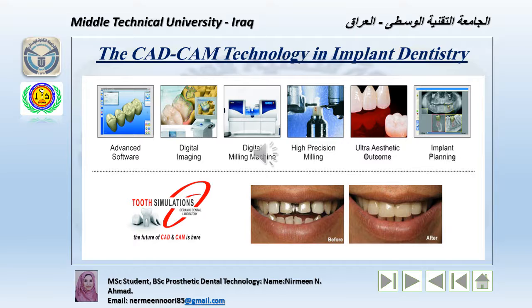Implant position within the virtual model of the patient's mouth considers the available bone density, the distance from the adjacent teeth and other implants, the fixture's proximity to the sensory nerve, and the relationship with the prosthetic end result. The designed implant placements are transferred into the surgical field by means of the customized surgical guide. The surgical guide is produced through the additive manufacturing process and geometrically controlled before performing jawbone osteotomies.